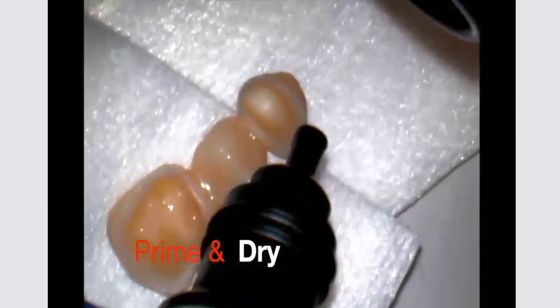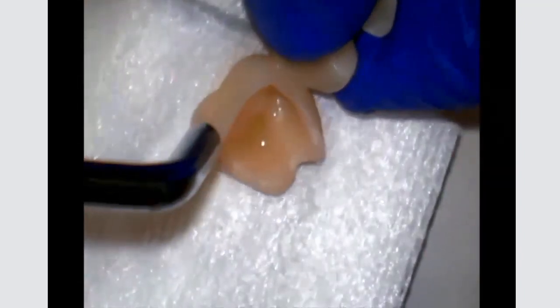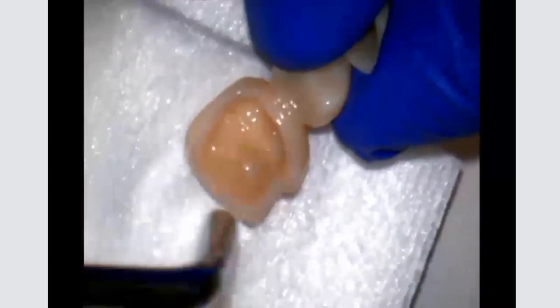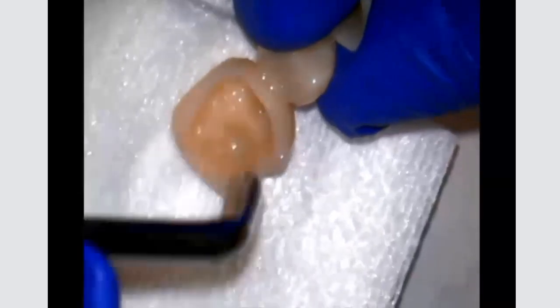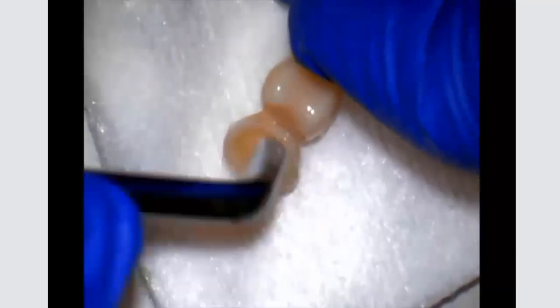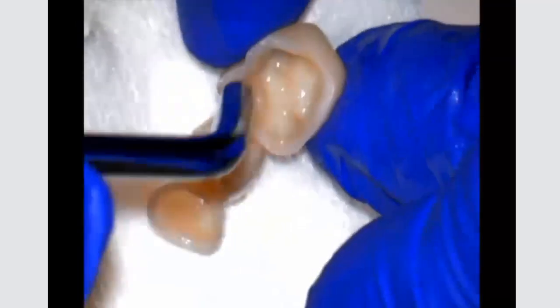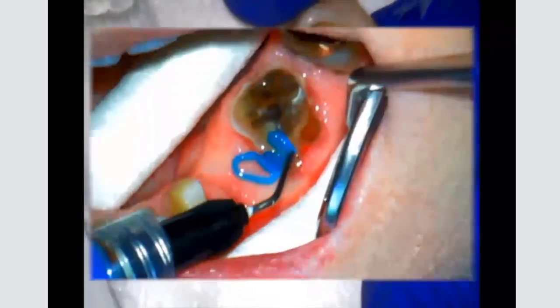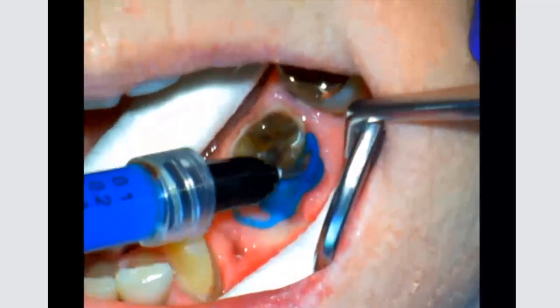But now I'm going to put a primer in. This is Z Prime Plus. Now I'm going to dry that. Good. Now my restoration will be ready to put in the mouth. So after I dry this primer in the restoration, I'm going to go back and now I'm going to prepare the tooth.